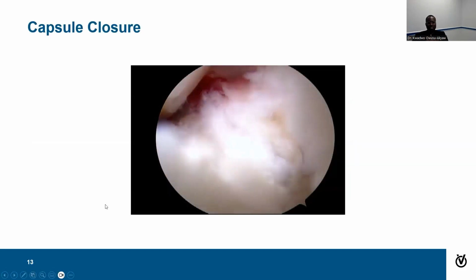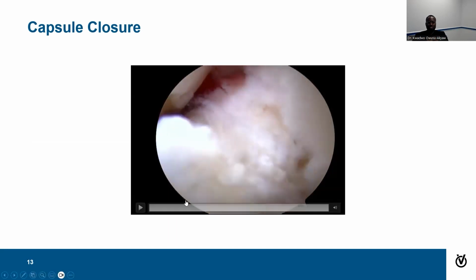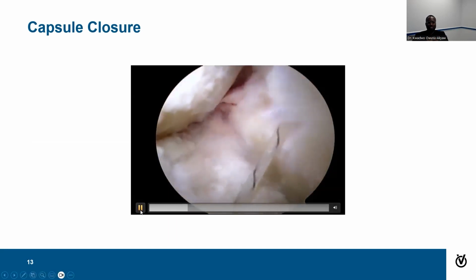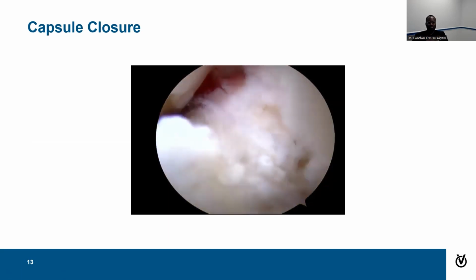All right, so we're looking inside the hip joint. What's happened here, and we'll run it back one more time, you can see where we had stitches in, and we passed them on both sides of the cut of the capsule, and we pull it down tight, and then we tie it down. On the next slide, you'll see how we tie it down.